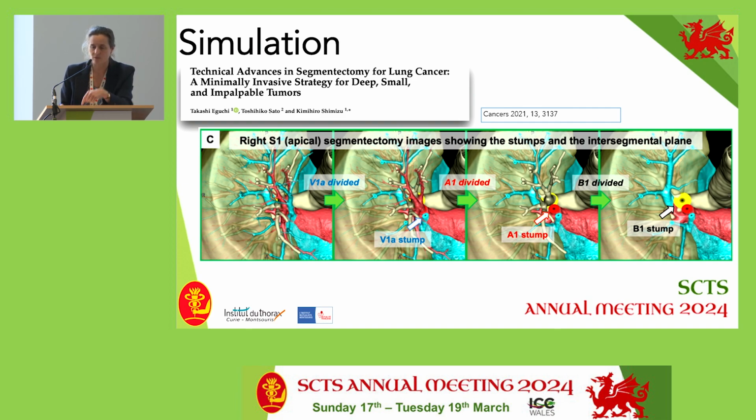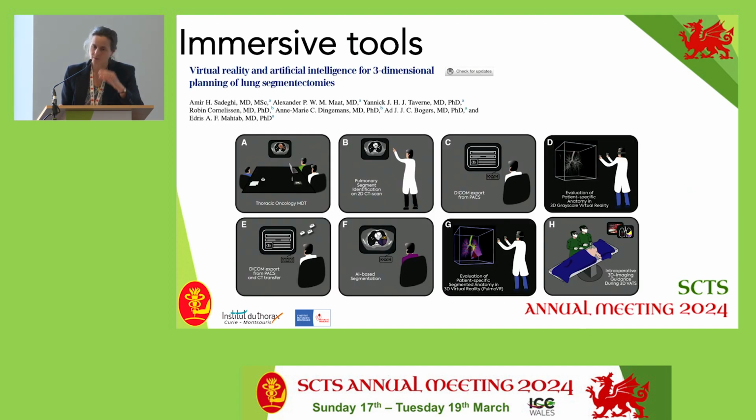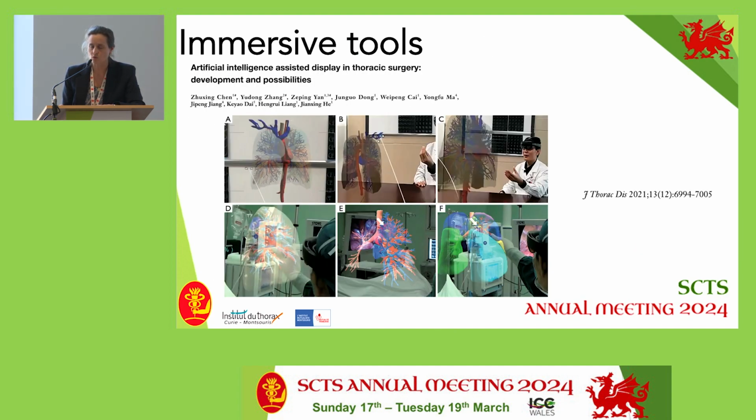And that came from that 3D reconstruction, where when you have done the steps, you can use the 3D reconstruction to clear the vessel that you have cut, and you will have the vision of the next step to prepare, and that's very helpful for education. Also for education, you can use some immersive tools like the HoloLens mask, and it's more virtual reality.